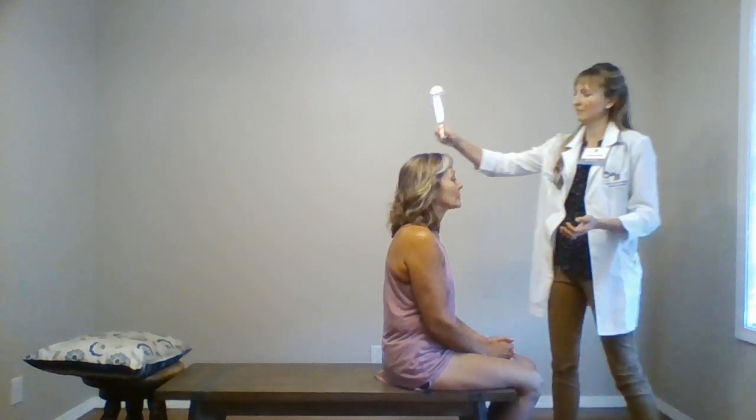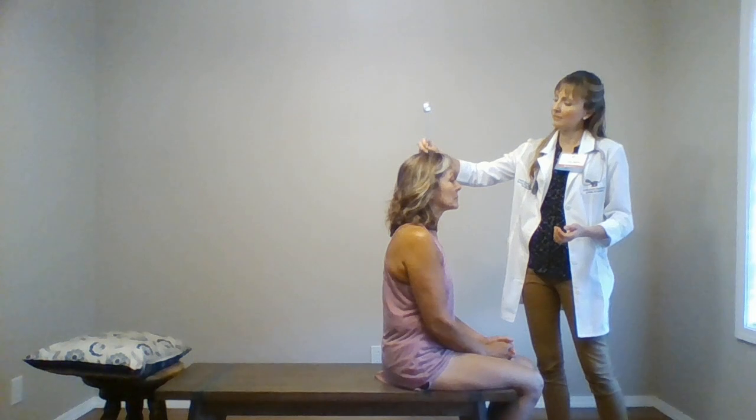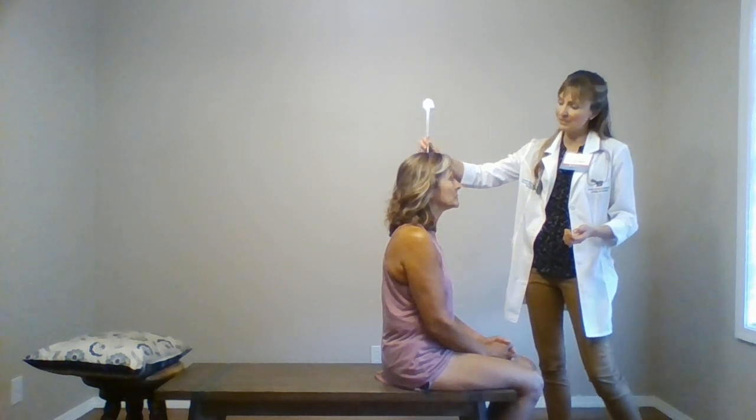And then I want you to tell me if you hear the sound equally in both ears or greater in one ear or the other. Okay. Hear it equally in both ears. Perfect. The next hearing test we'll do is called the Rinne test.